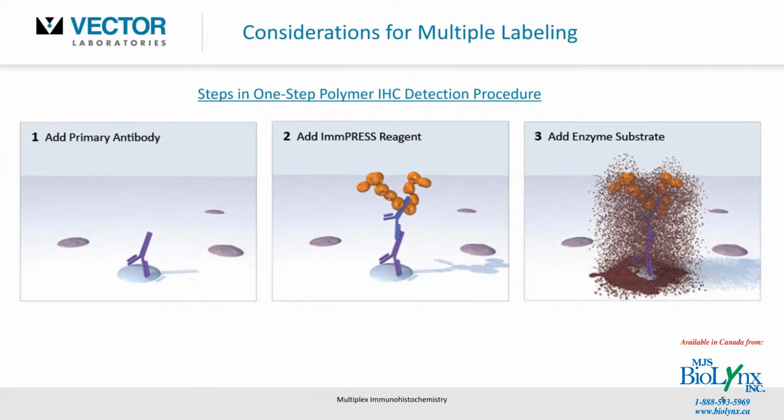And you don't get to decide what sort of specimen your tissue is from, and it could be rodent-based, for example. So we're going to go through scenarios then that if you already have in place a single label such as this, but you want to introduce a second or a third label, we'll look at some of these parameters.